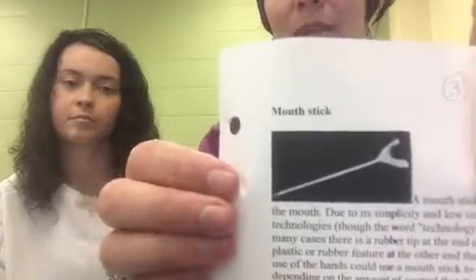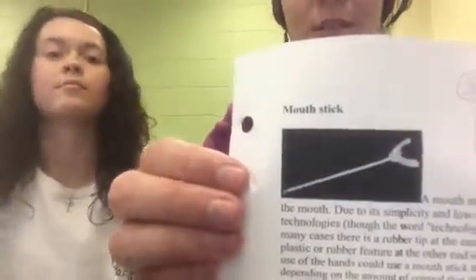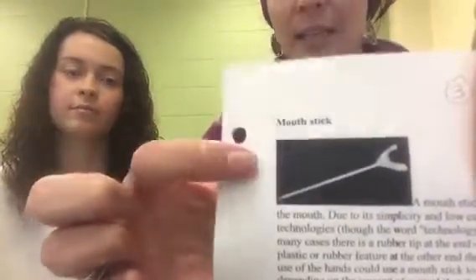Okay, so when people do have a spinal cord injury, a lot of them can still move their arms, but in some cases they can't. But in that case, they're going to use a mouth stick, and I don't have a mouth stick, but it's a stick and it somewhat has a pointer on it, and then it has a mouthpiece in it where you put in your mouth. It looks kind of like this. I'll show you a picture. Yeah, like this. This is a mouth stick. There's all types and different kinds, but this one's the most basic.